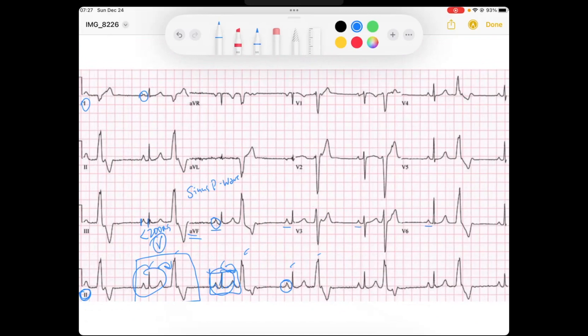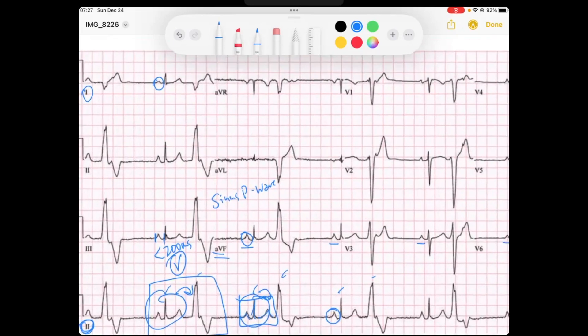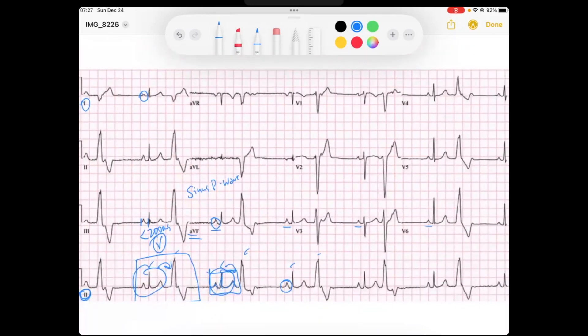Nothing is changing. Our QRSs are narrow. My QRS is upright in lead one and upright in AVF, so I know that means it's going down to the left, which is a normal axis.